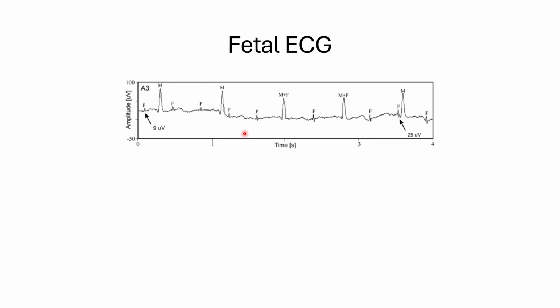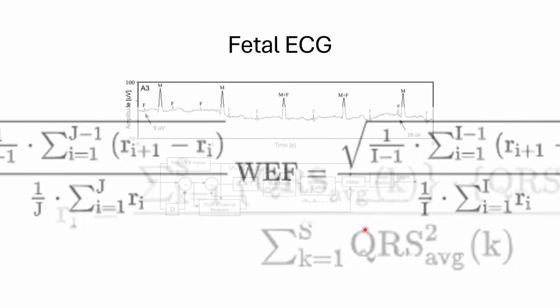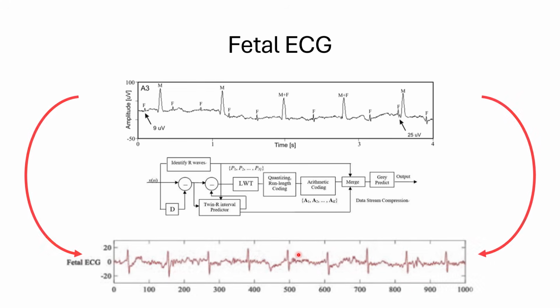And then this goes through a filtering system in the ECG machine, where a lot of math happens and you get this scrubbed out, filtered out signal of the fetal heart rhythm, which still is not very clean and is not legible enough to evaluate anything besides the fact that this heart rhythm is a regular rhythm.